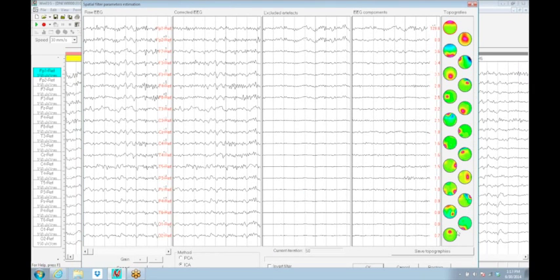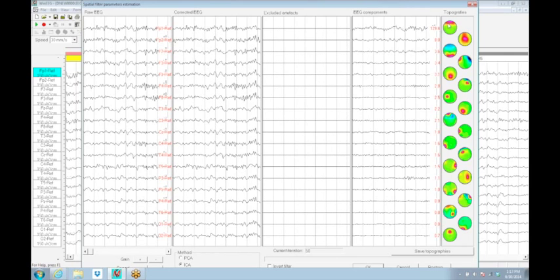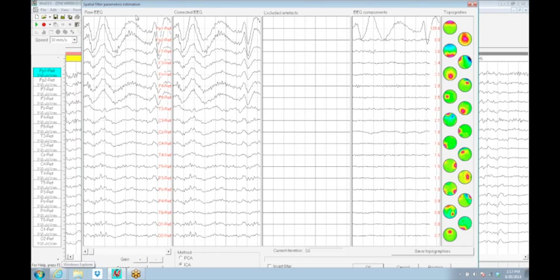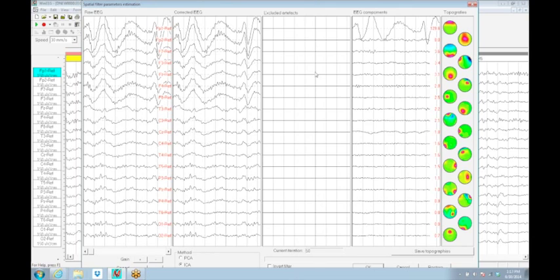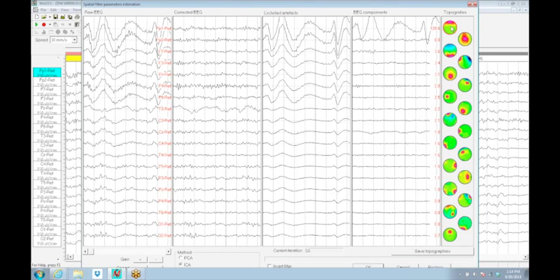It's just finished. Now you can see the generators are more discrete spatial generators. The top one is automatically selected. I'm going to deselect it so we can see the display. This is the raw EEG. We can scroll through the EEG. We now see eye movements. This is the EEG corrected of any artifact that's been selected to pull out. This top component up in the front of the head has the big morphology of these eye movements. I'm going to select this component. This is the eye movement component.